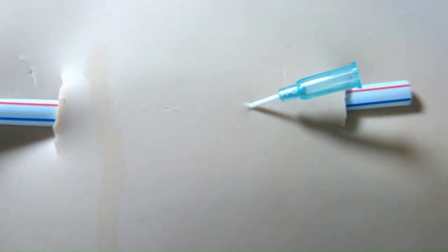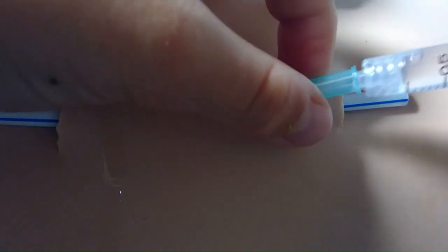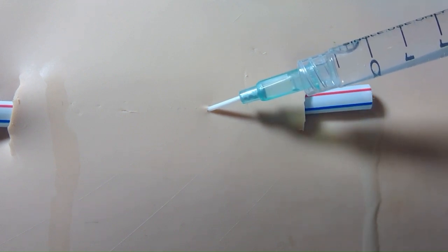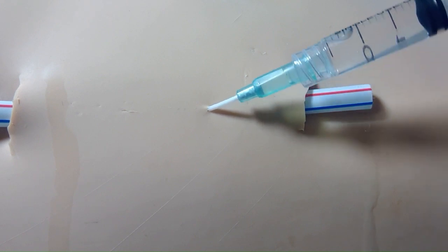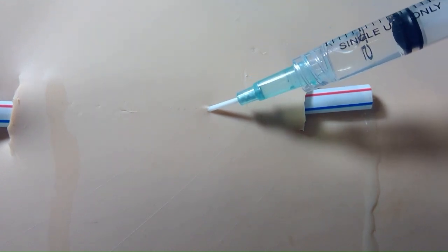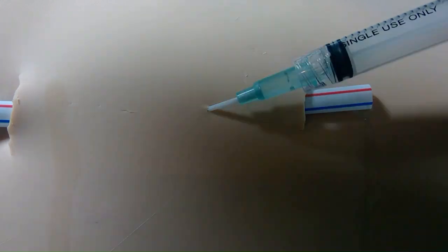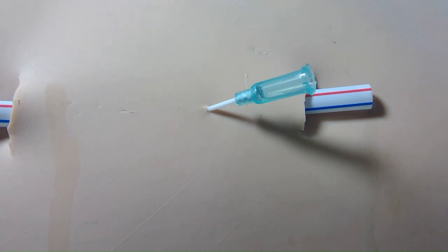Now that we're at 2.3 milligrams — let's call this medication ondansetron — I'm gonna hook it up to the IV and slowly push the medicine in. Very slowly push it in. And that's how you administer medication through an IV.